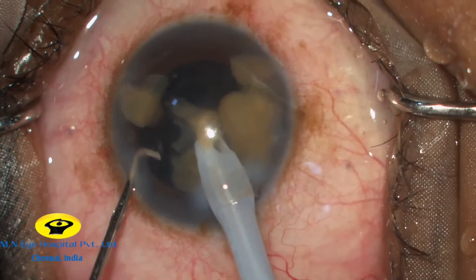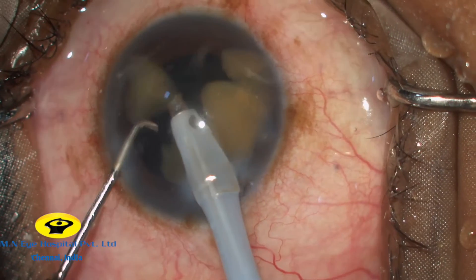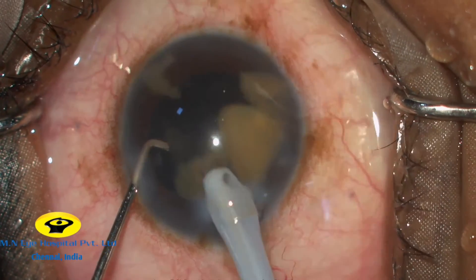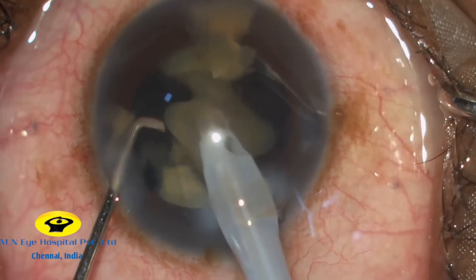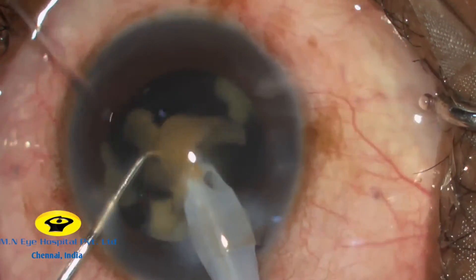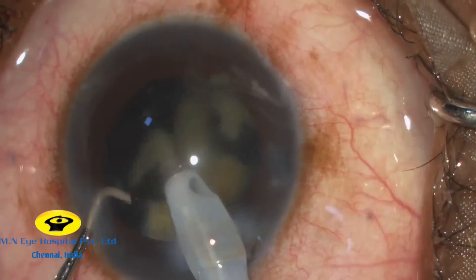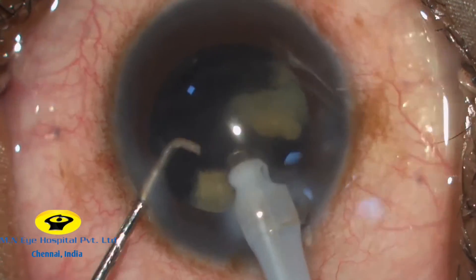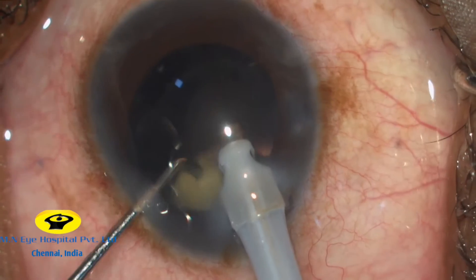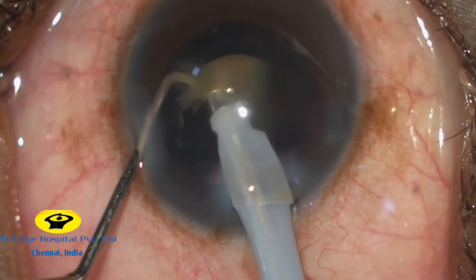As you can see, very good followability is achieved and the anterior chamber is well maintained throughout. Because of this, we can use high vacuum and very little FACO energy in these hard cataracts. Special care should be taken while FACO emulsifying the last fragment.